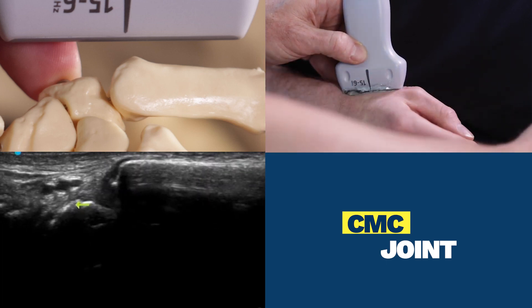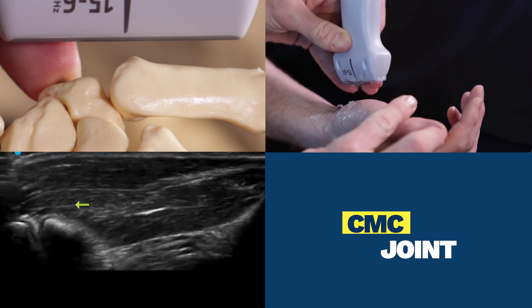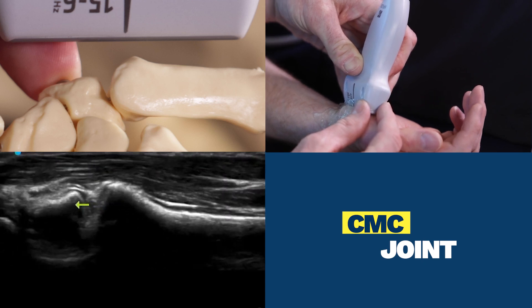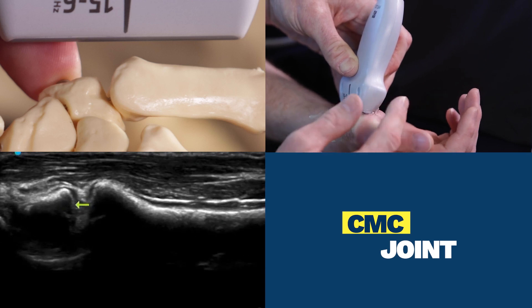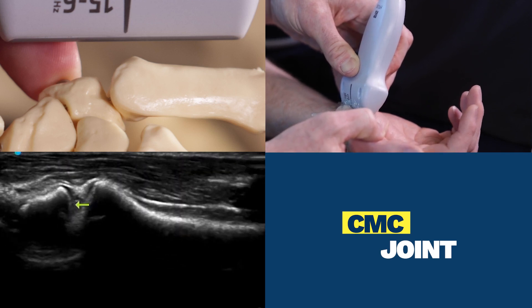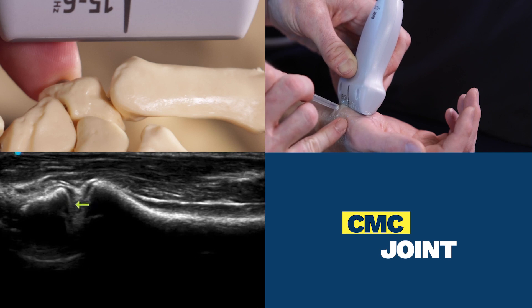However, to be more safe, I could make a slight modification by supinating the hand — going back to basics, long on the metacarpal. My movement is going to be to the end of the metacarpal, and now once again you can see the area of interest right where the yellow arrow is. With a bit of passive extension, you can see the metacarpal and the CMC joint space open up. My angle of entry of the needle is like this.